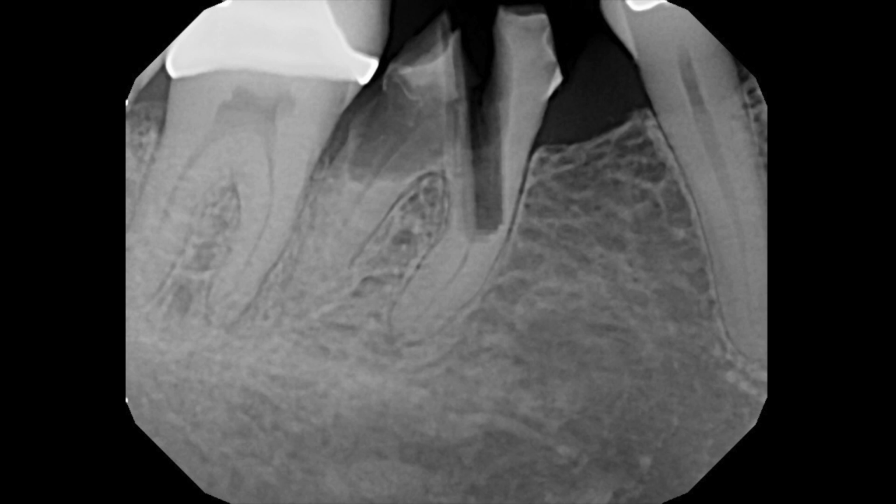After I found that this path wasn't the right way, for the corrected path I had to remove pretty much that mesial occlusal part of the clinical crown in order to get the correct axis. Otherwise the burr starts running up against the side wall of the already prepped section. So whenever you're taking out a tooth that has a non-typical parallel alignment, when it is tipped, then of course you have to make sure that your drill is tipped and your drill isn't straight like that.